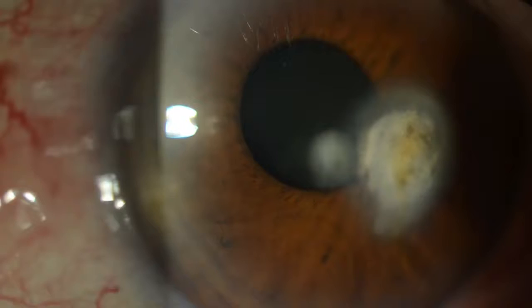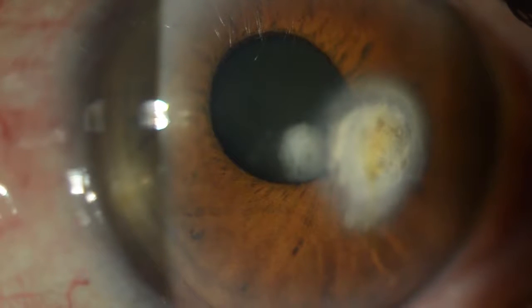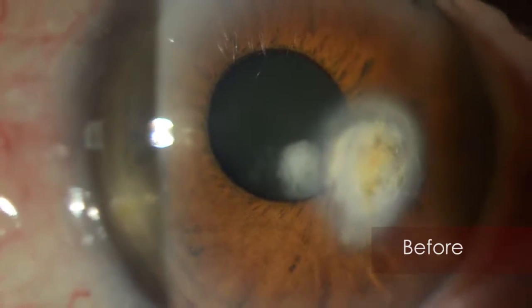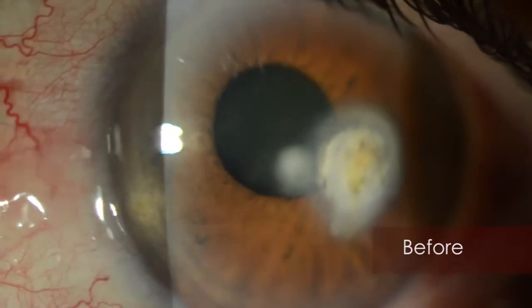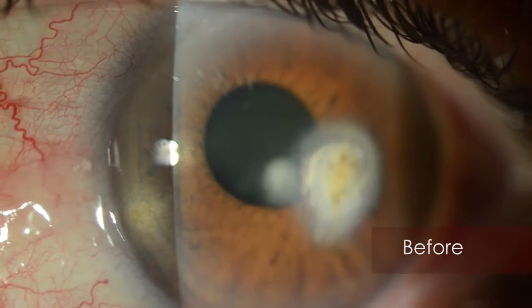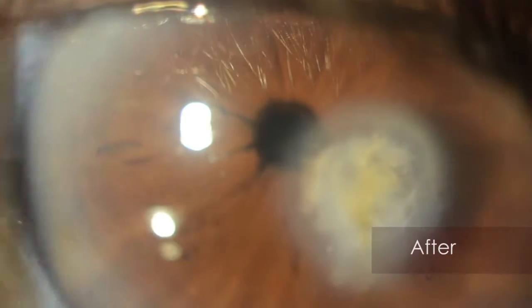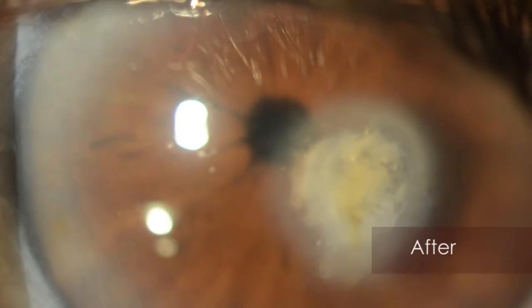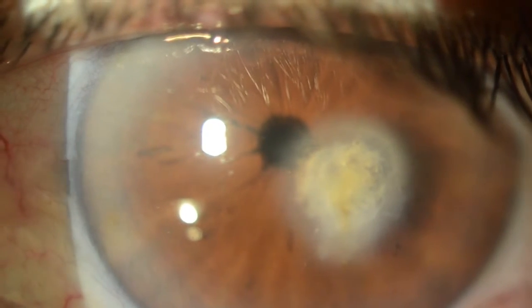We should also bear in mind that despite the recent advances in corneal transplantation, performing only the cataract surgery will result in surprisingly good outcomes in these challenging cases, depending on the severity of the corneal opacification. In the case at hand, although there is a significant central corneal scar in an amblyopic eye, performing the cataract surgery along with the implantation of a toric IOL resulted in a fairly good outcome.